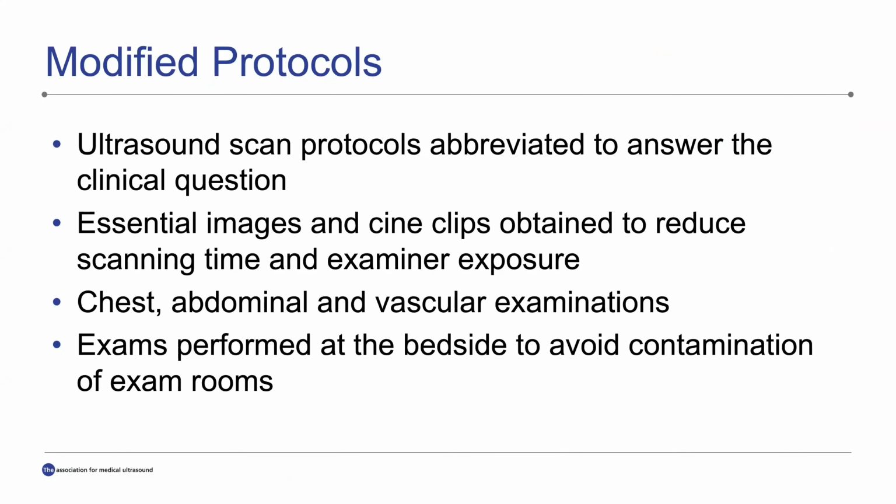I'd like to finish up with just a few slides about some of the practices that we have changed in response to the surge of patients that we saw with COVID-19. We abbreviated our ultrasound scan protocols to just answer the clinical question.